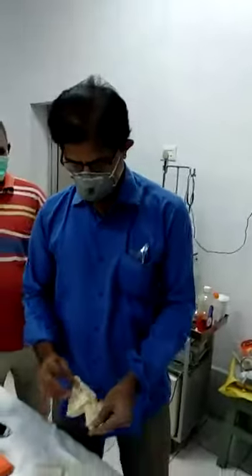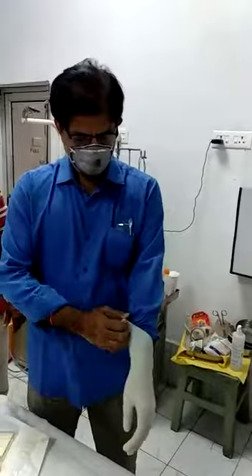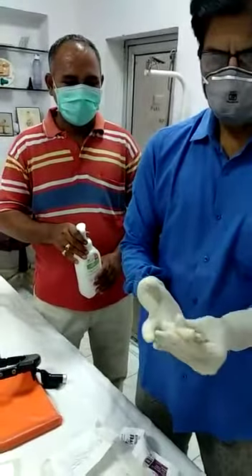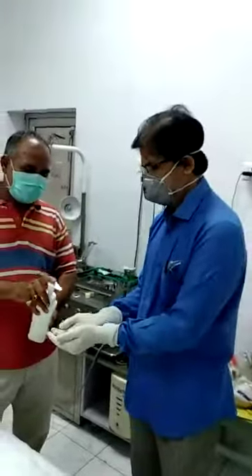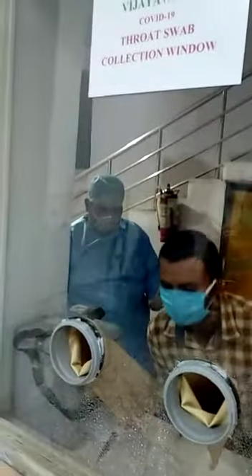This is the second case for which the sampling will be taken by Dr. Ravikant again. It is getting ready, almost ready. Sanitizing the hands with sanitizer. The patient is also ready, and the hands have been sprayed another time.